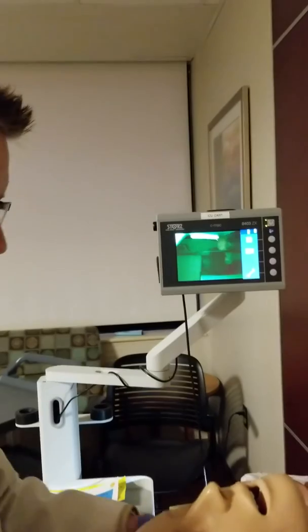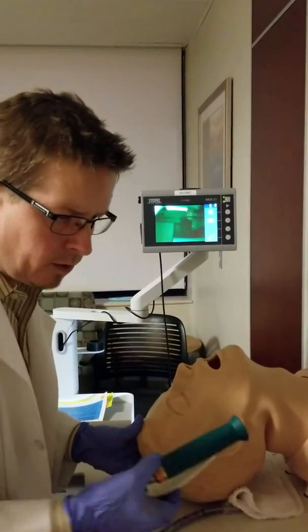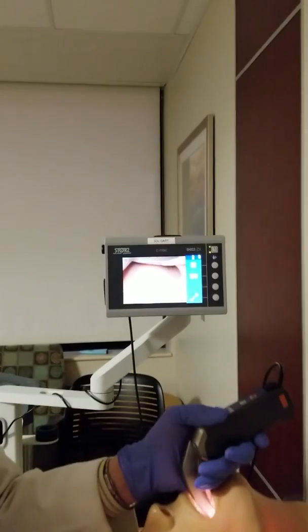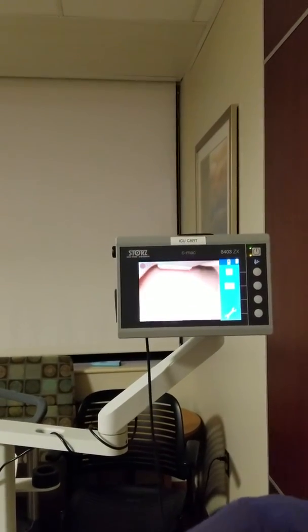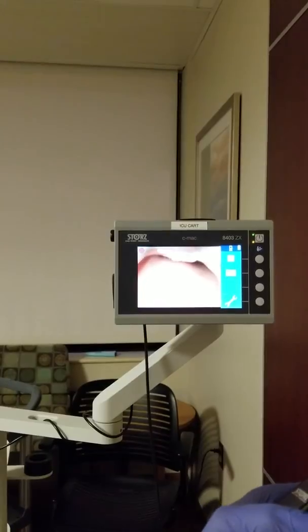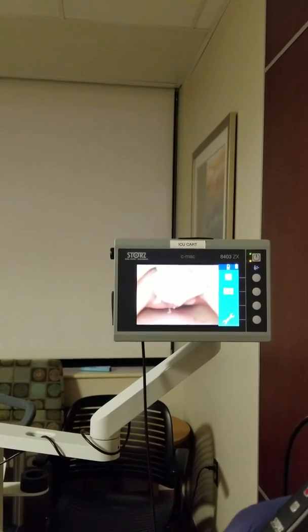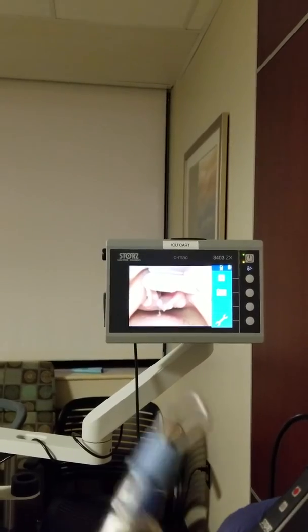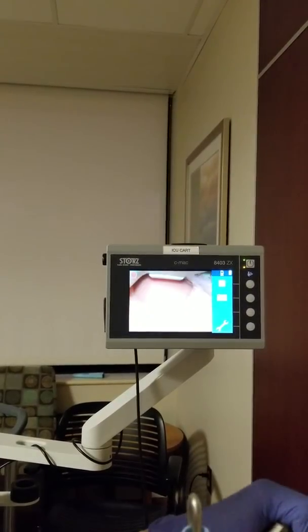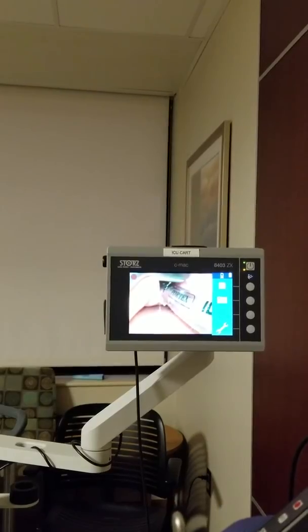So let's see what it looks like in this guy. This one's a little bit more challenging to intubate — it's a fairly new intubation head so things don't move quite as well. You're going to see what I'm seeing. There's the tongue. I'm not dive bombing and going crazy, just nice and easy on the landmarks. I can identify landmarks; I know exactly what's underneath that. Then I'm going to grab the blade, visualize it, go right through the cords. You almost don't even need a chest x-ray for confirmation on that — that's a guarantee you know where the tube is, at the right depth. See the line there just in front of the word vortex? That's where the cords are supposed to sit.